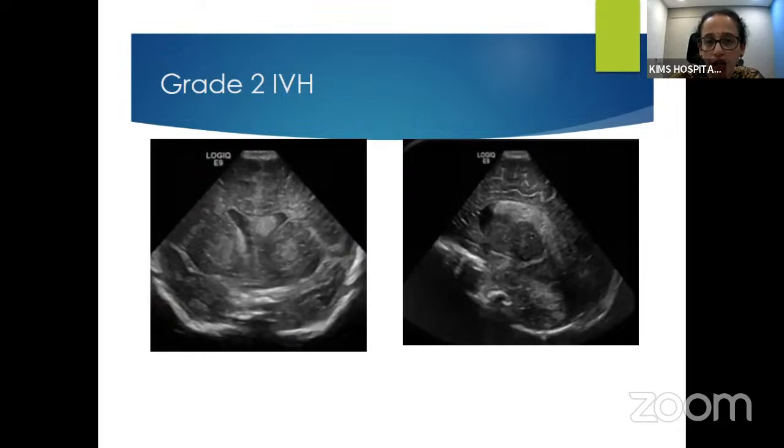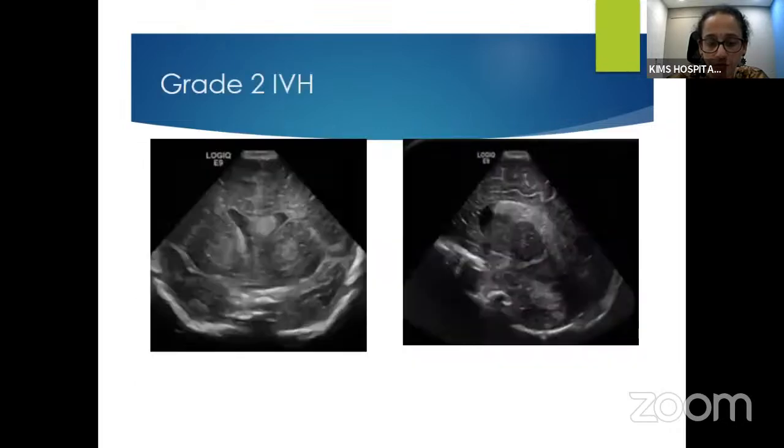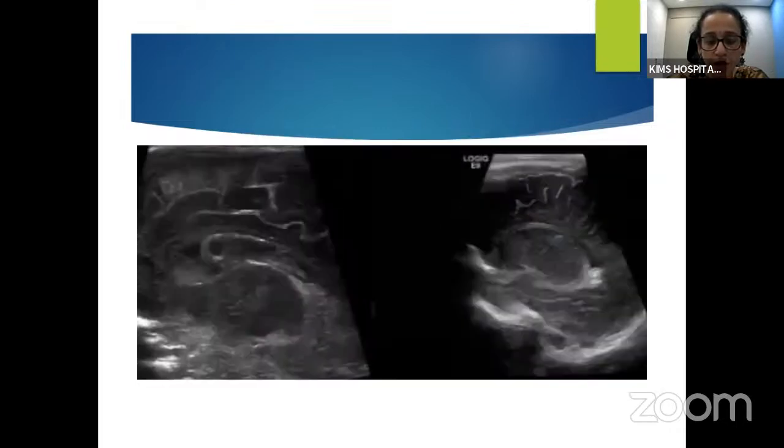So this ventricular dilatation should be graded at the time of the bleed of the baby, because later on, whenever the baby had a grade 2 of IVH, it may develop a post hemorrhagic hydrocephalus. Then at that time we cannot say whether it was a grade 3 in the beginning. So whenever there was a bleed, at that time itself we should differentiate whether there was any ventricular dilatation or not, and grade the baby accordingly. So this was the grade 2 IVH without any ventricular dilatation.